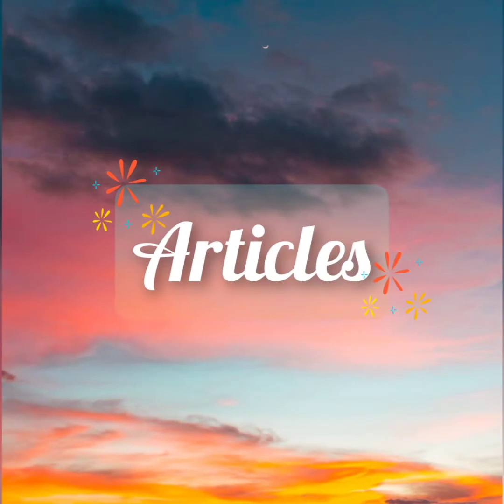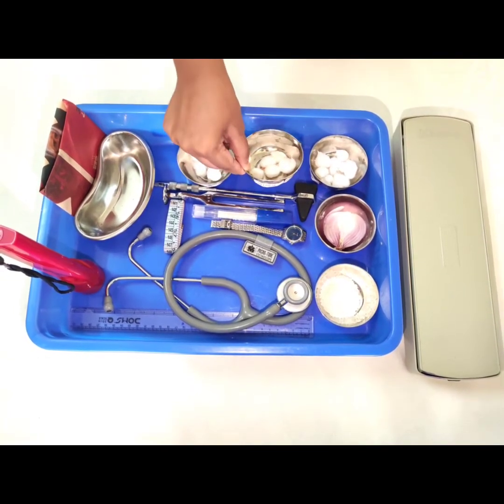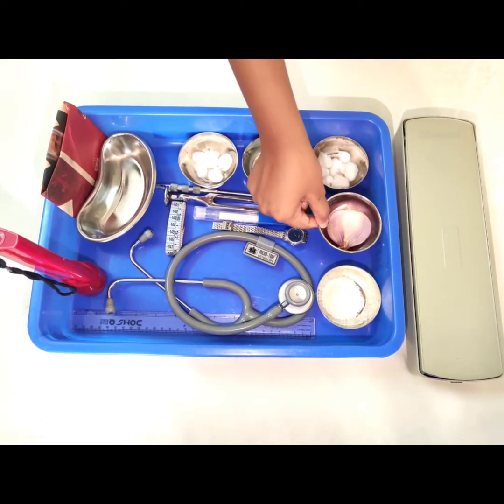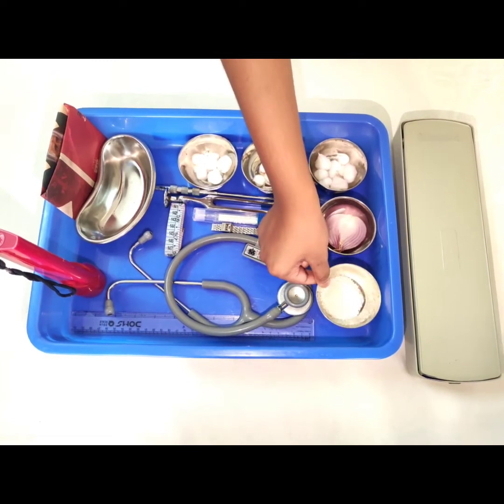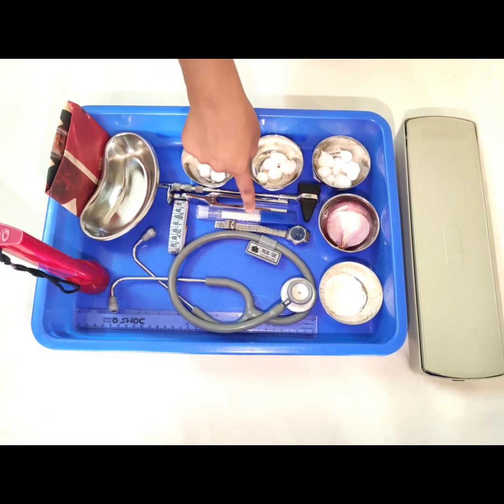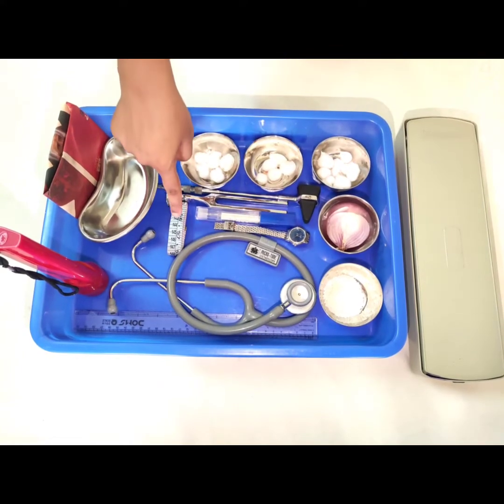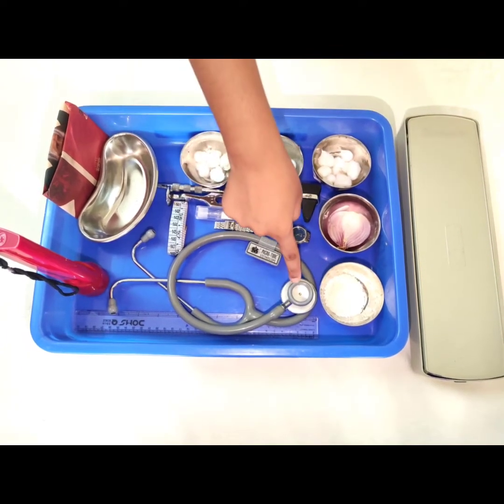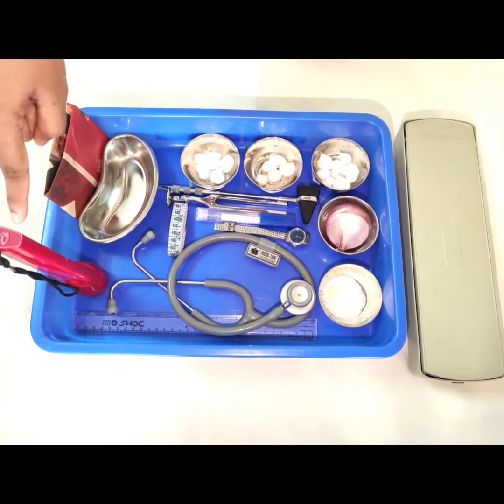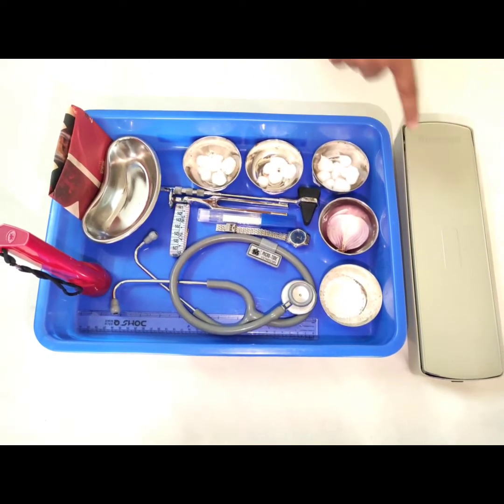Articles required: a clean tray containing dry swab, wet swab, soapy swab, onion for smell, sugar for taste, hammer, tuning fork, thermometer, a wristwatch, measuring tape, stethoscope, ruler, torch, kidney tray, paper bag, and a sphygmomanometer.